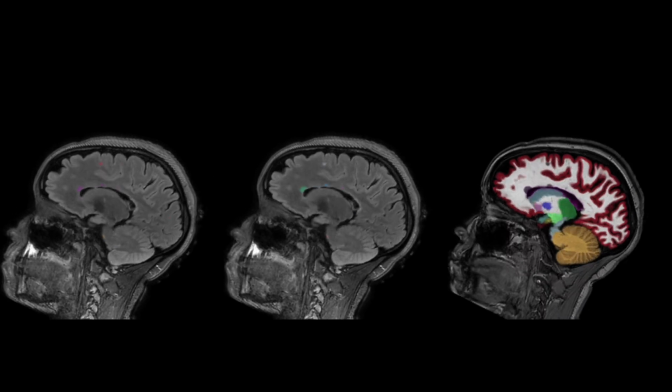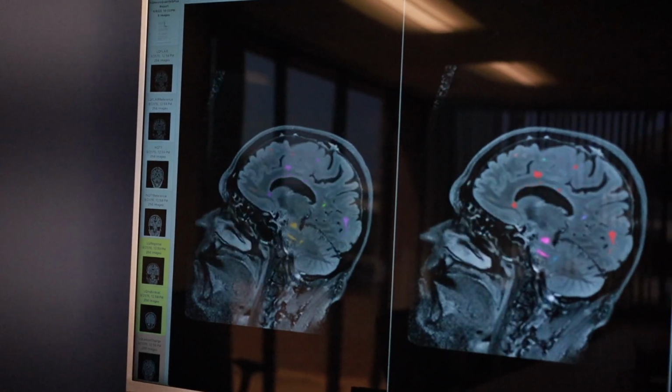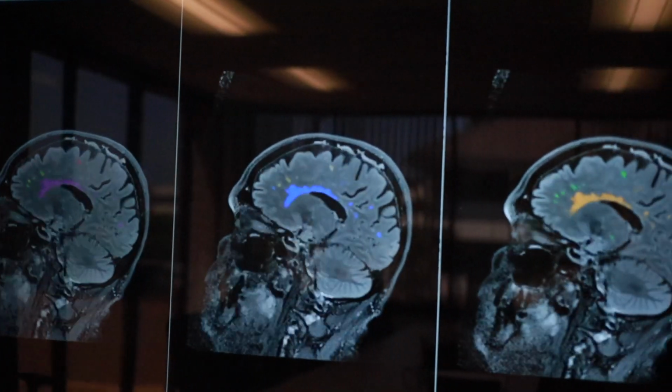And then, very importantly, it will incorporate the prior study. MS patients tend to get scanned once a year. It will incorporate the prior study, and it will calculate lesion dynamic change over time. So it will tell you the number of plaques that are increasing in size and number, and what's new, and what's shrinking, and what's staying stable.